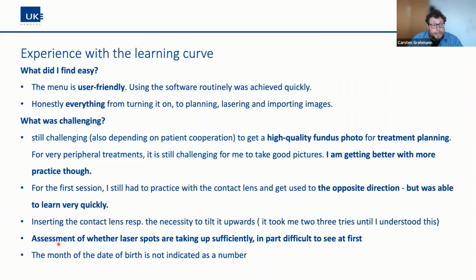You learn very quickly. Assessment of whether laser spots are taking up sufficiently: that's also challenging at the first approaches, to find the right energy, whether the laser spots are burned properly or not. We have found in our clinic that mainly gray spots change color after some days, so they get darker. There is no need to have a really white spot at the first approach.